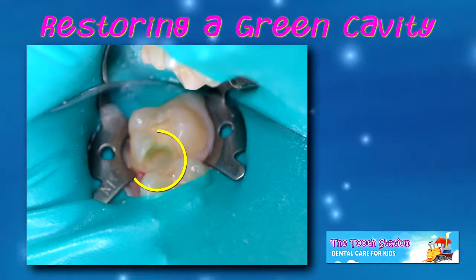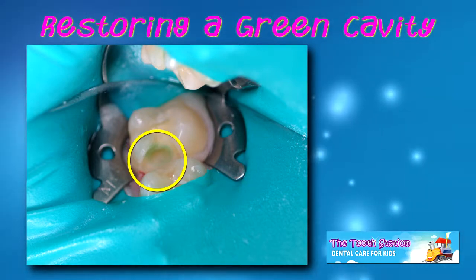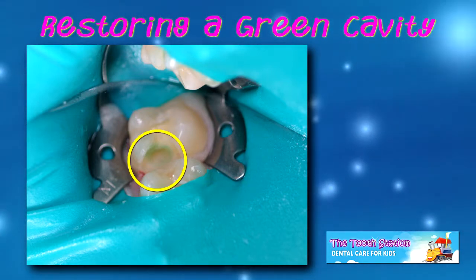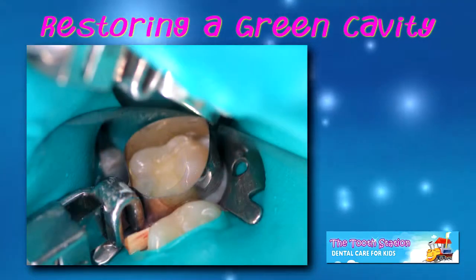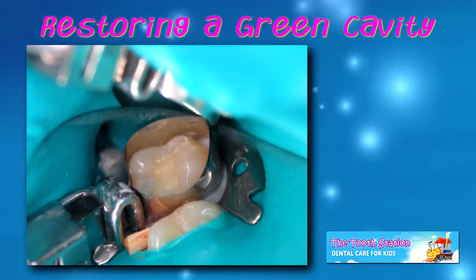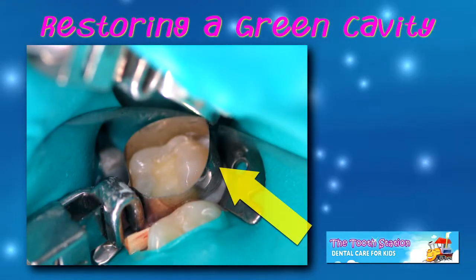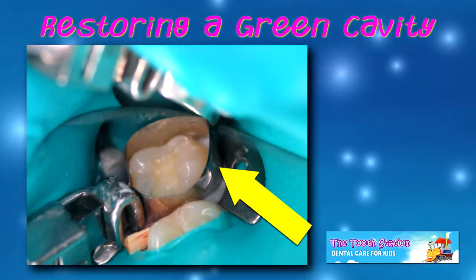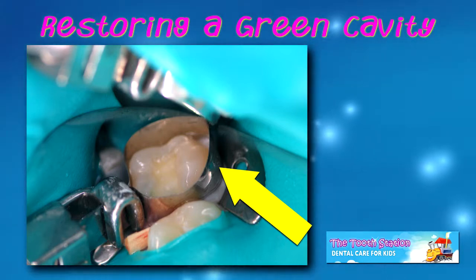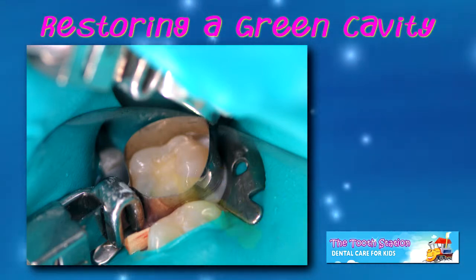This photo was taken after most of the green cavity has been removed. This was a large and deep cavity. This photo was taken when the filling material was starting to be placed. The metal band is called a matrix and is used to keep the filling material from flowing out before it gets hard.